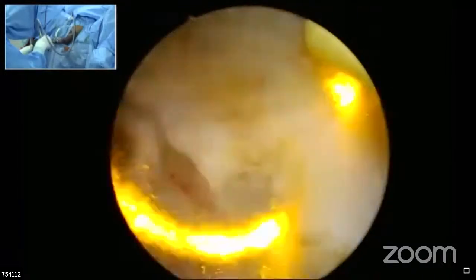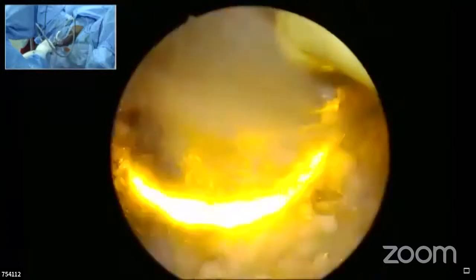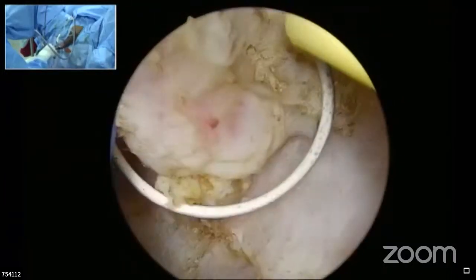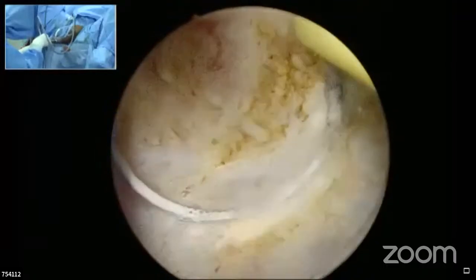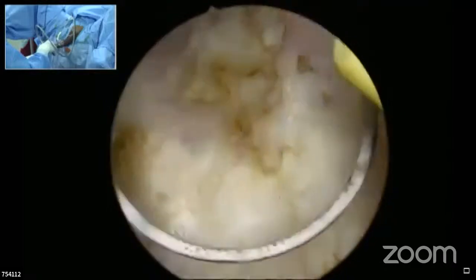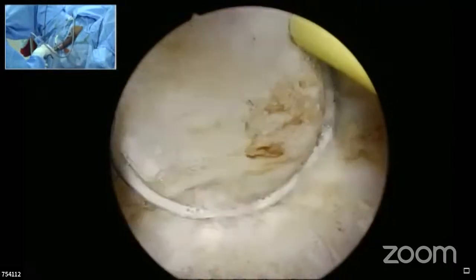Yes, yes. Eclipse. Technodyne Corporation was the company which started off. They just got that circuitry and then the technology changed. They are not able to match it because the whole technology is now chip-based technology. Earlier it was valve-based. That was all, some sheets used to come. Now it's software-based, chip-based technology.